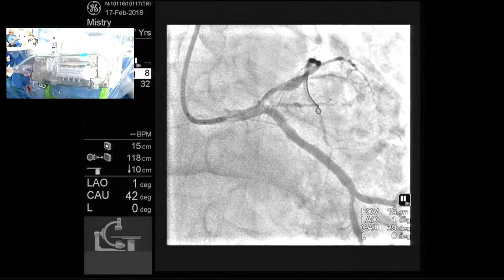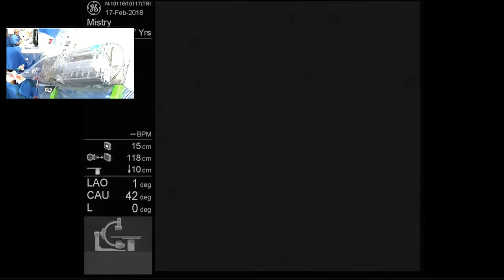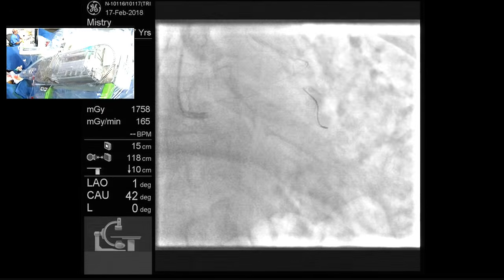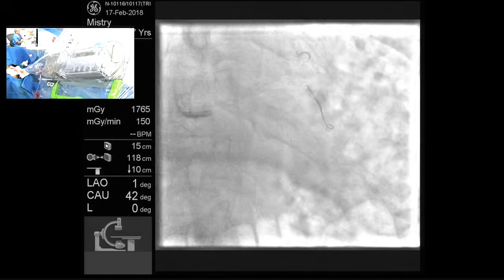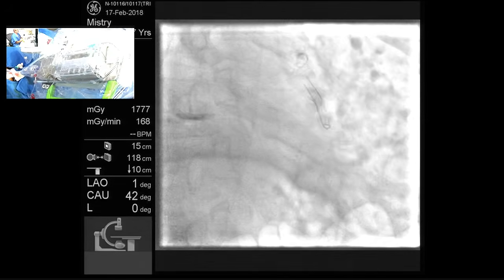Stent loaded. Stent loaded, enable all. This is Turbo. I have taken Onyx because of these angulations. This is one stent I can trust.